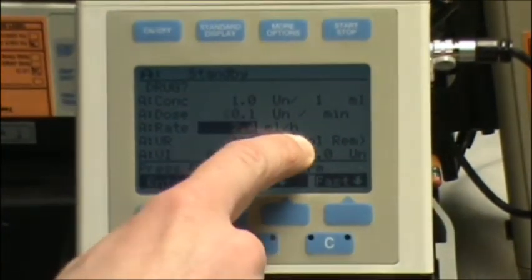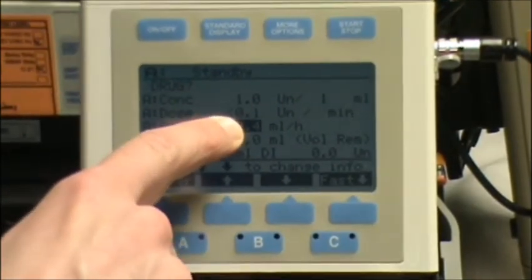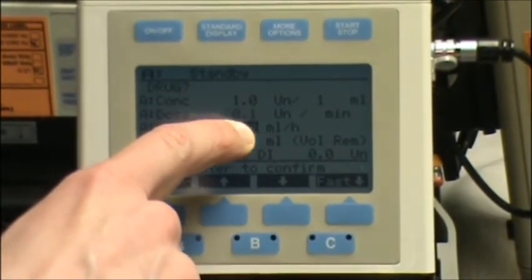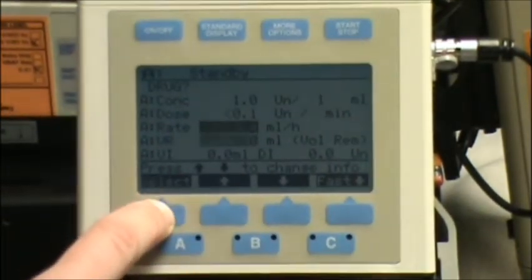2.4 mLs an hour comes out to a dose of less than, so the less than symbol shows up here now, 0.1 units a minute. Press enter.